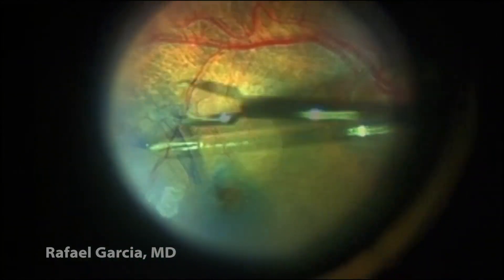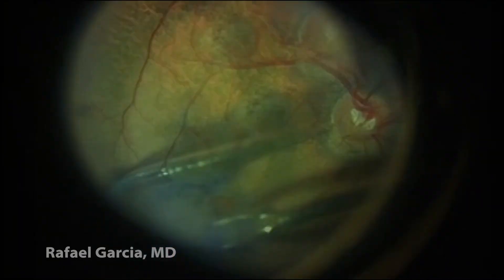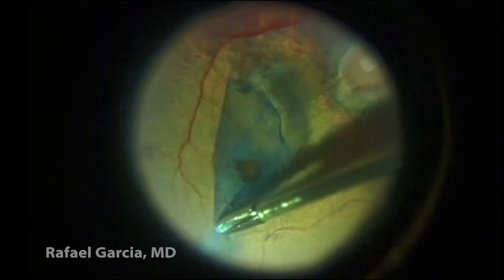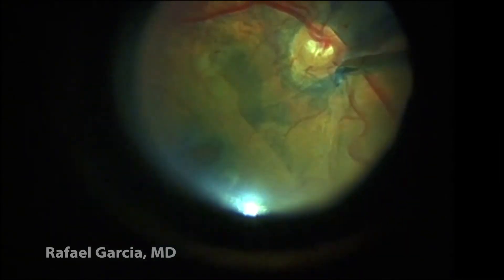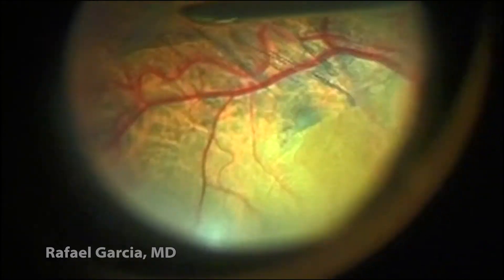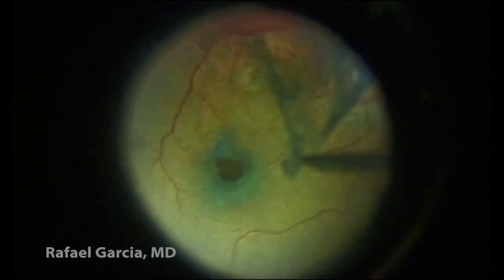The contact viewing system is being used here. When we are addressing the macula, we put on a direct contact lens, which we believe can really enhance the visualization of the ILM, and thus can be very handy in this step. Multiple grasps are usually needed to maintain the vector forces necessary to perform a round-shaped peeling. It's interesting to see the removed membrane on the tip of the forceps.